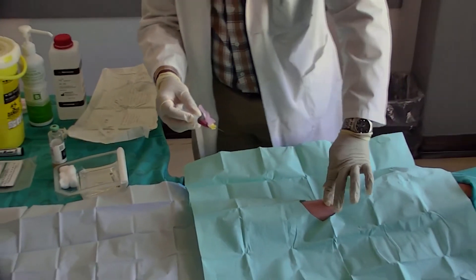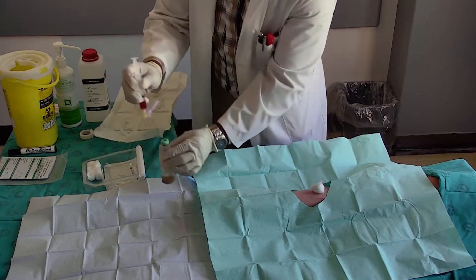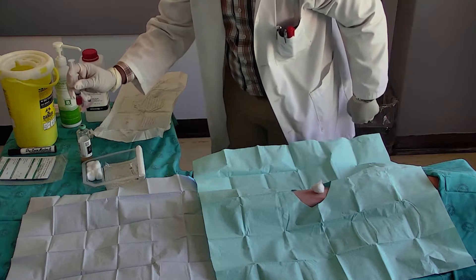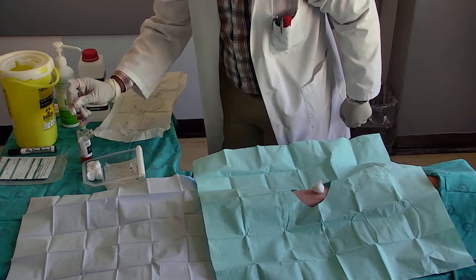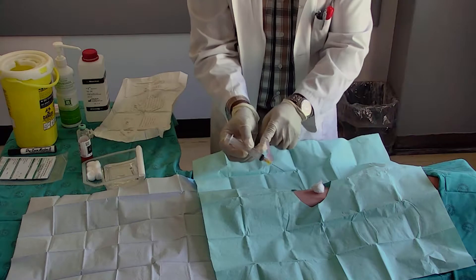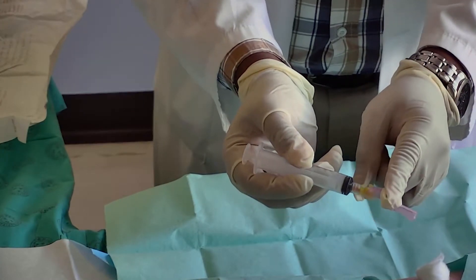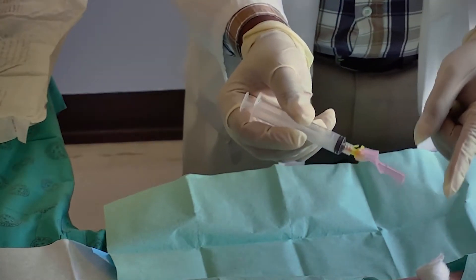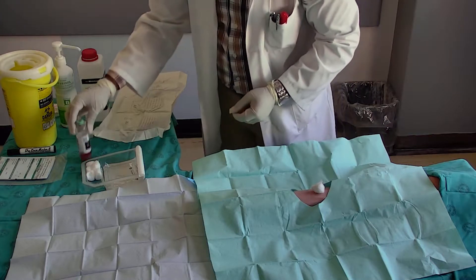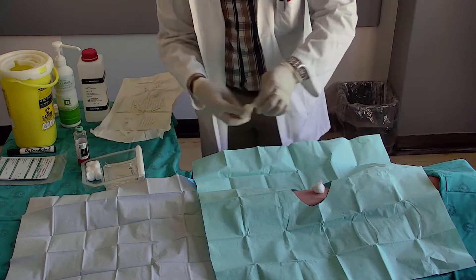Do not change needles between the blood sample collection and the inoculation of the blood culture bottle. Do not hold onto the blood culture bottle during inoculation, as this increases the risk of needle stick injury. Inoculate the blood into the blood culture bottle. Engage the safety needle cover immediately and discard it with the syringe into the sharps container. Gently rotate the bottle. Secure the cotton ball with tape.